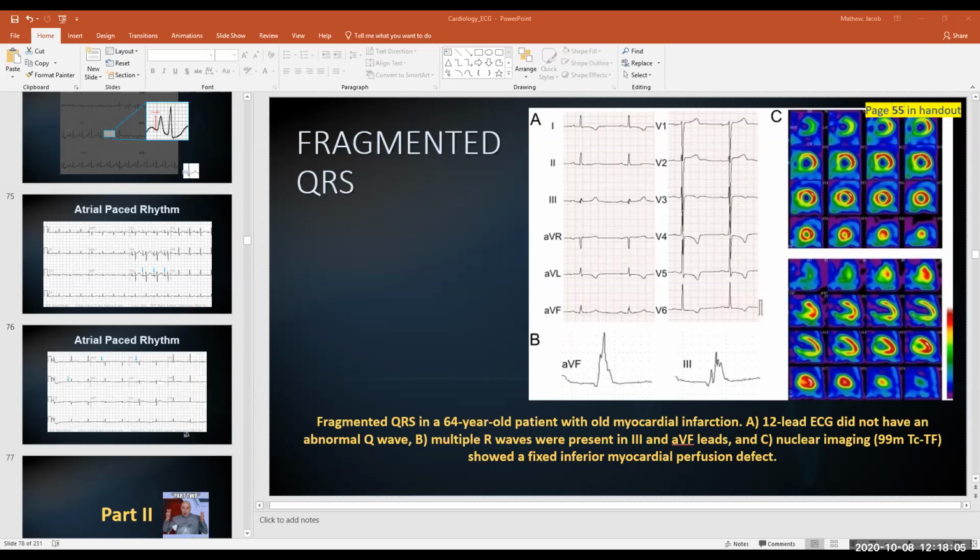It can be a harbinger, preceding patients that actually have cardiovascular disease. It doesn't mean there's a timeline associated, meaning that if you see this, oh my gosh, you need to get them in the cath lab now. No, it just means that if you had a patient who potentially didn't want to be on a statin and was high risk otherwise, you could use this as a reason: hey, I'm already seeing some changes on your EKG that suggest you have a higher chance of progressing, or of already having silent ischemia or cardiac disease. Maybe we should do the statin. Or if you have someone with non-specific symptoms and you see this on the EKG, you could bring that up with cardiology.